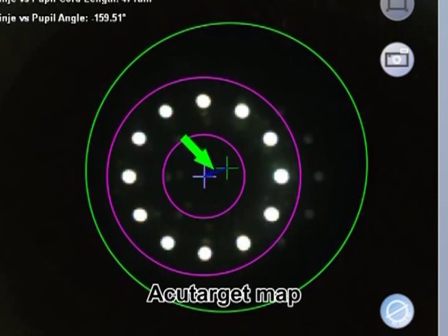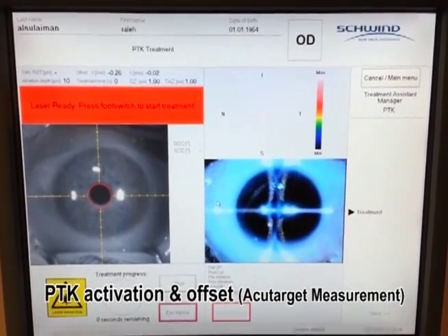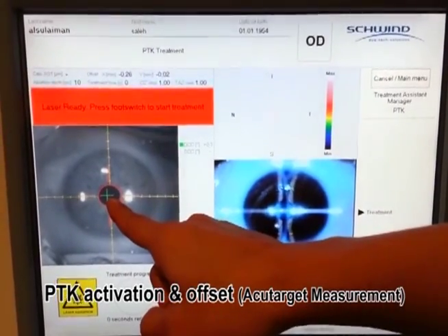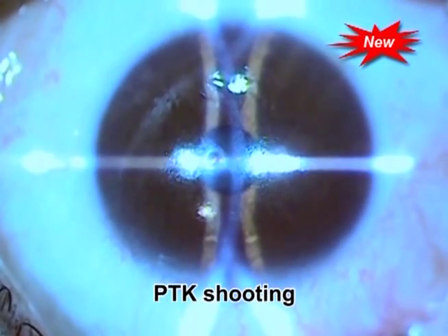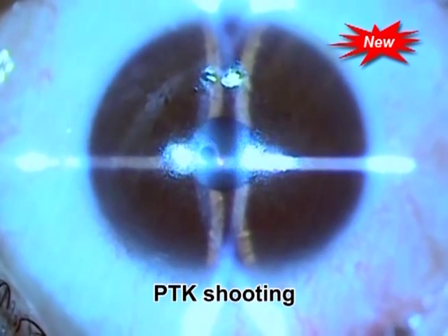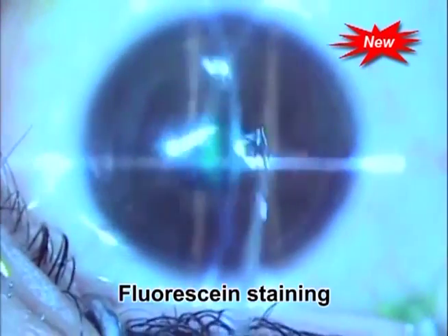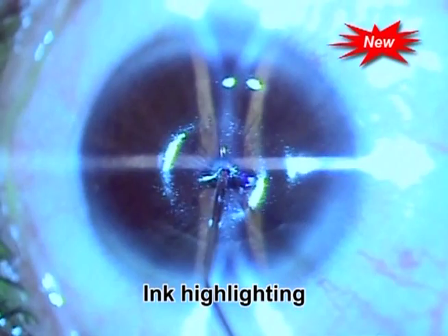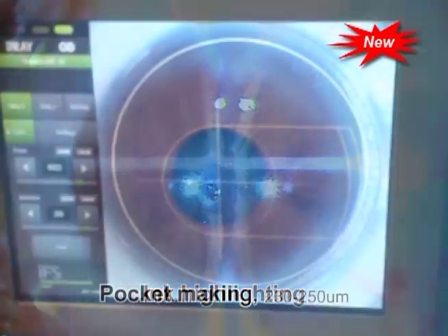Then we activate the PTK using the excimer laser machine at 10-micron depth and 1-millimeter diameter according to the AcuTarget map measurement. We shoot the PTK on the cornea, then stain the area with fluorescein, wash it, and highlight the area with ink so that we know exactly where we want to keep the inlay.